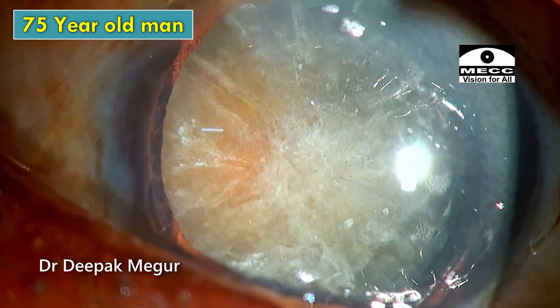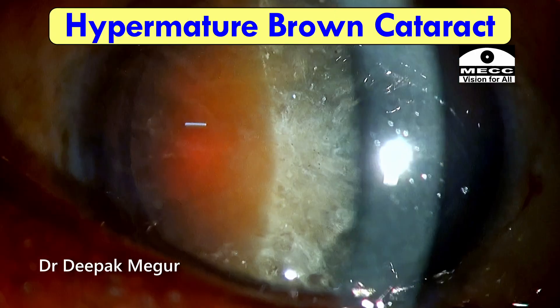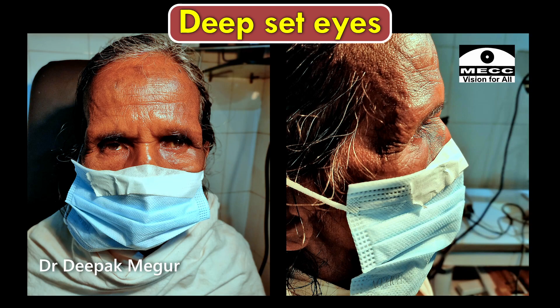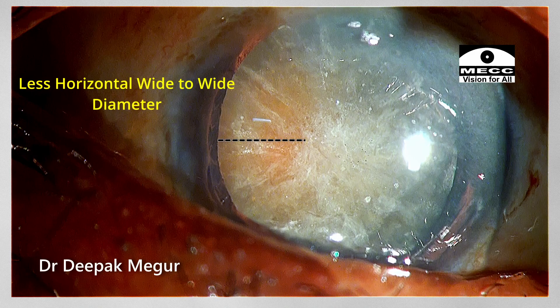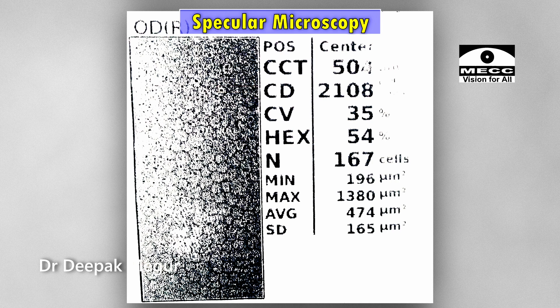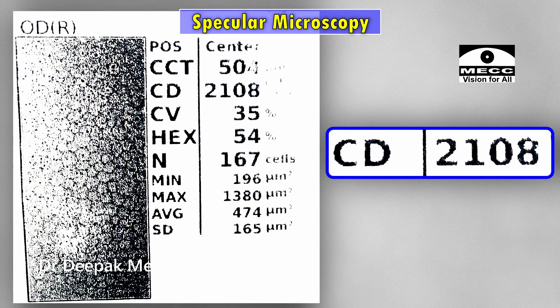This is another 75-year-old man with a hypermature brown cataract. He has very deep-set eyes and the horizontal white-to-white diameter is also very less — the eyeball looks slightly smaller. Specular microscopy shows around 2100 cell density.